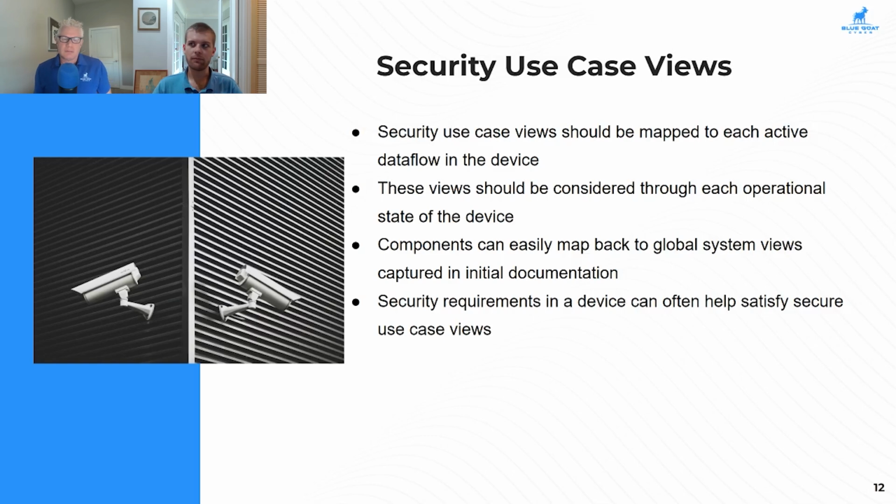For an example, USB is another great example to bring up here. USB, first being universal, is meant to be a very flexible interface. It can deal with a lot of different protocols and a lot of different data transfers. Understanding how security maps to all of those can be really difficult, where understanding how the functional operation of all of those can be a lot easier. So I think that's a little bit of where the knowledge divide ends up happening with the manufacturing teams.